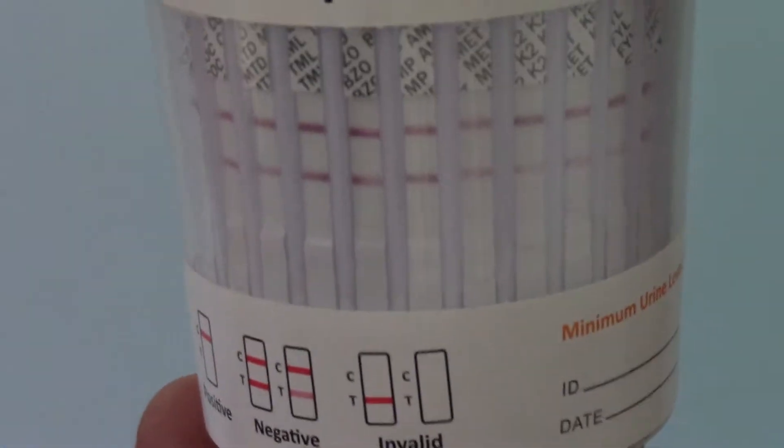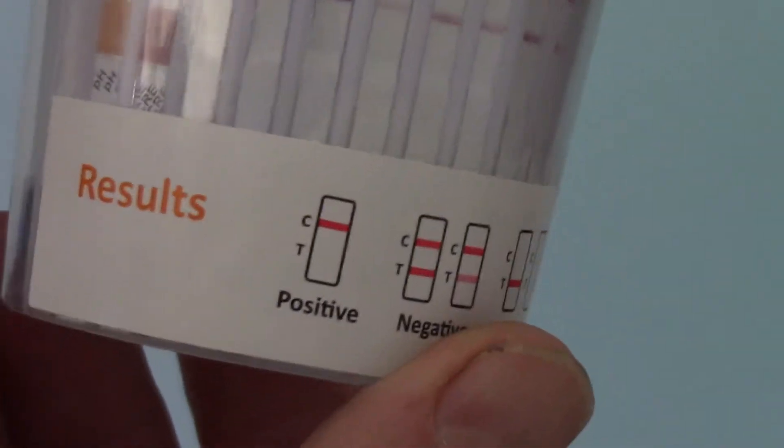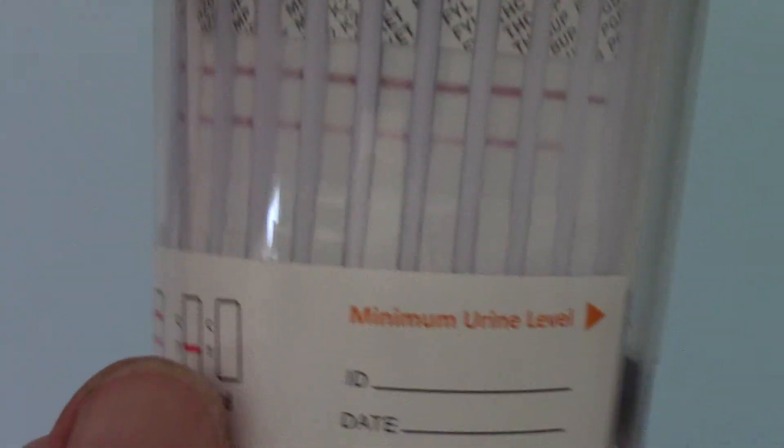So that is a very important point when you come to interpretation of these results. If any result was positive, there would be absolutely no line showing at all in the presence of the control line.